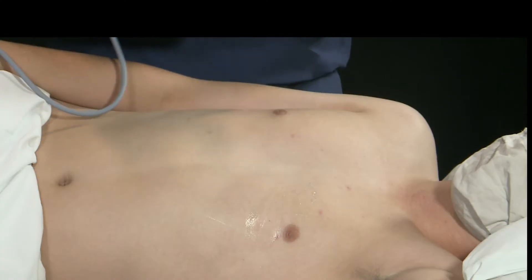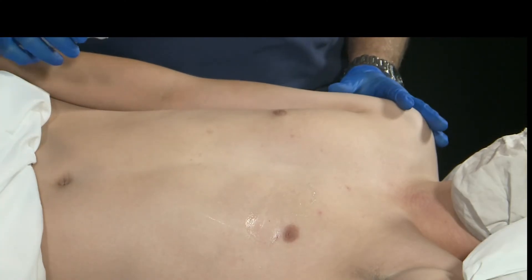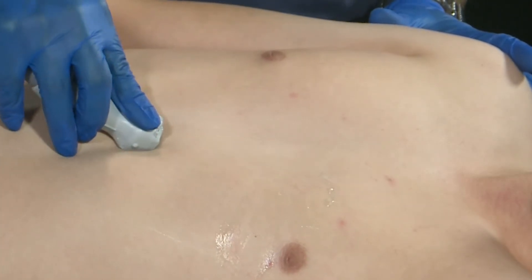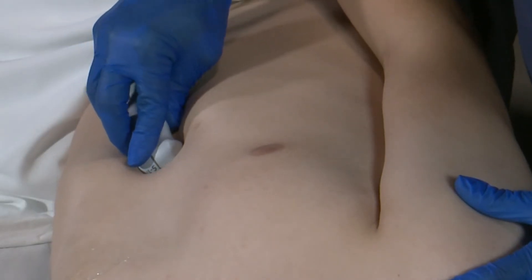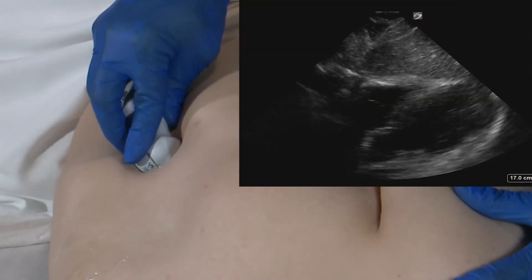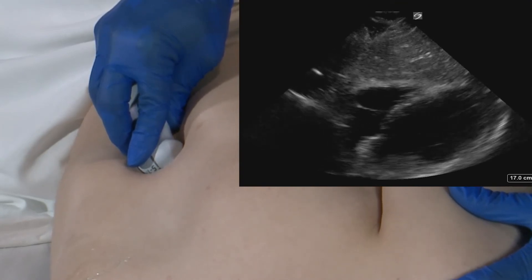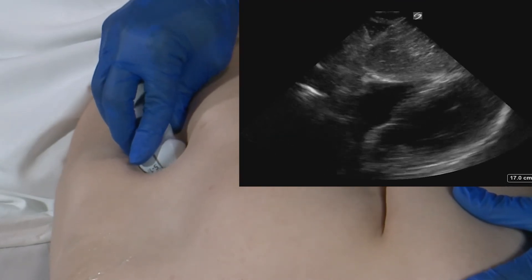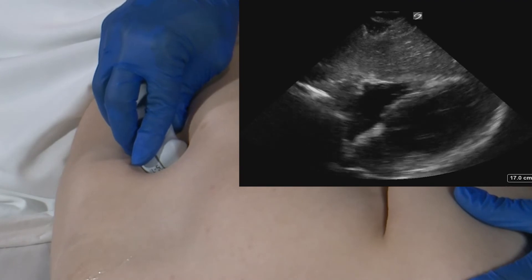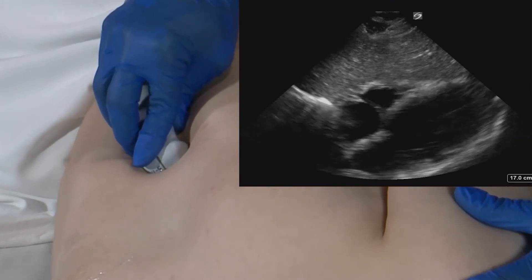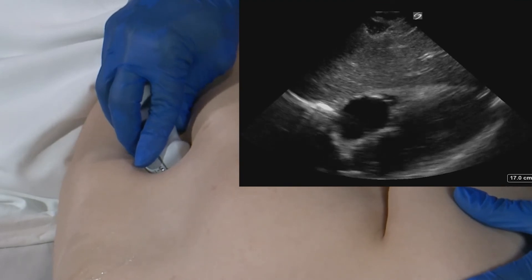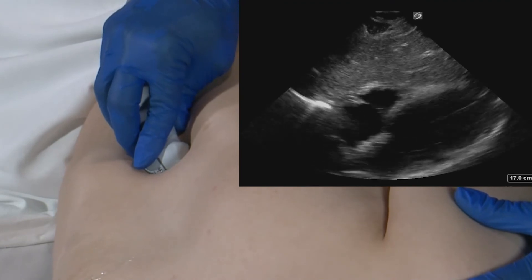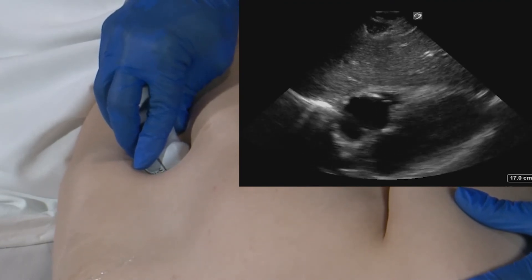Next, we'll be ready to move towards an image in our subcostal window. This will be done by placing the transducer immediately underneath the xiphoid process, with the marker dot directed towards the patient's left flank — similar to the orientation of the apical four chamber view. We're going to lay the transducer almost flat against the abdominal wall. Here, we're looking through the liver and identifying the right ventricle, the right atrium, the left ventricle, and the left atrium, paying particular attention to the pericardial space to identify a pericardial effusion.